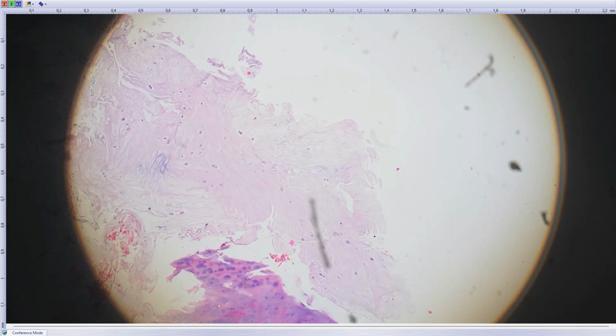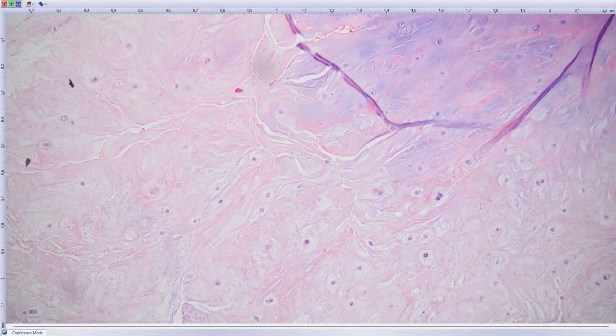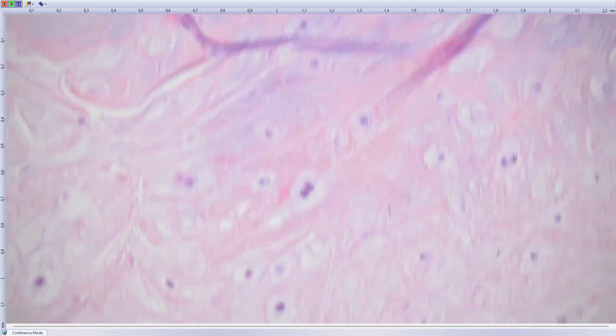All right. So this is a 46-year-old male who had a sarcoma diagnosed like a year or two ago on his femur, and now there is a suspicious recurrence or metastasis in the T4 spine. Again, the tissue was not very nice to work with. These fragmented pieces of cartilage, where still, however, you can see it's not normal cartilage. This looks atypical. We have lacunae with multiple chondrocytes, prominent nucleoli.